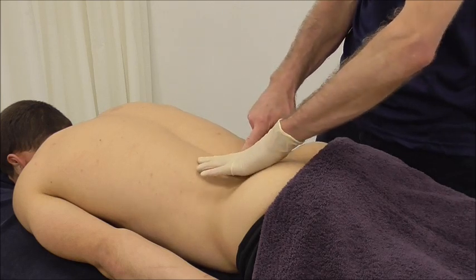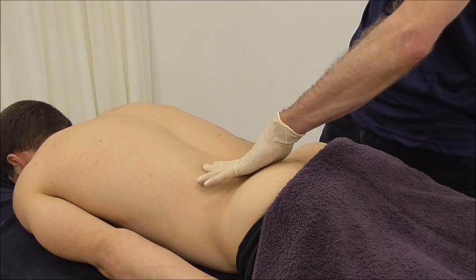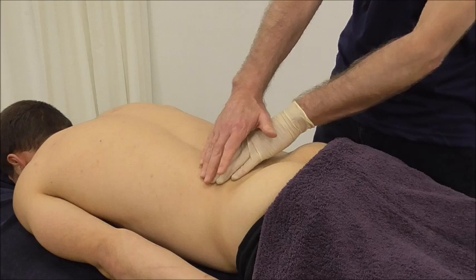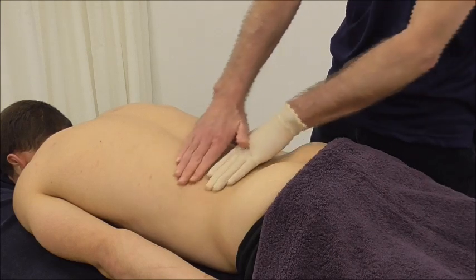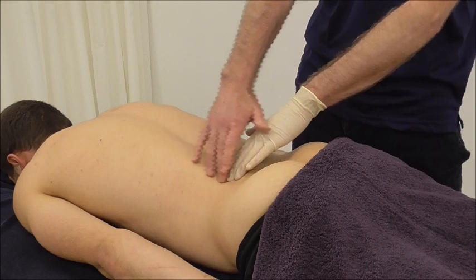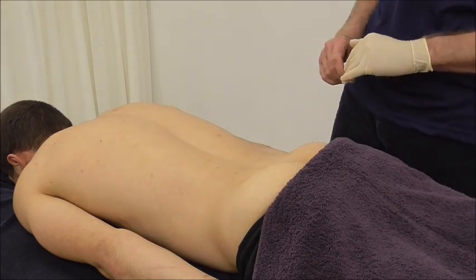As we come further out we're onto our longissimus, which is two to three finger widths broad. Further out still we come to our iliocostalis. Beneath that we have our quadratus lumborum, and over the top we have our oblique abdominals coming in and attaching to the lateral rib and to the lateral border of the thoracolumbar fascia.